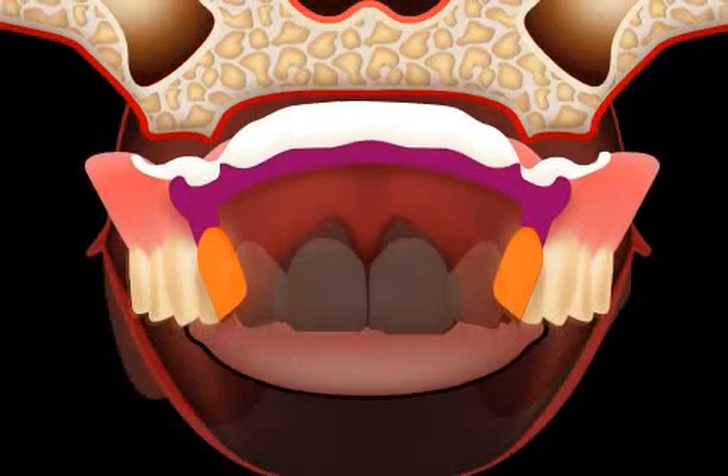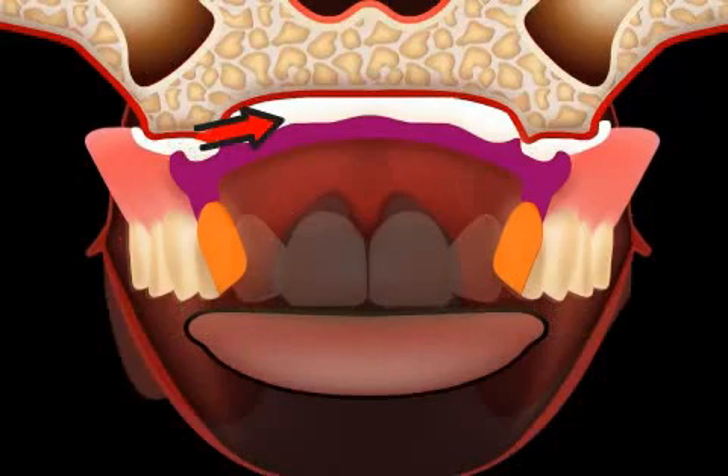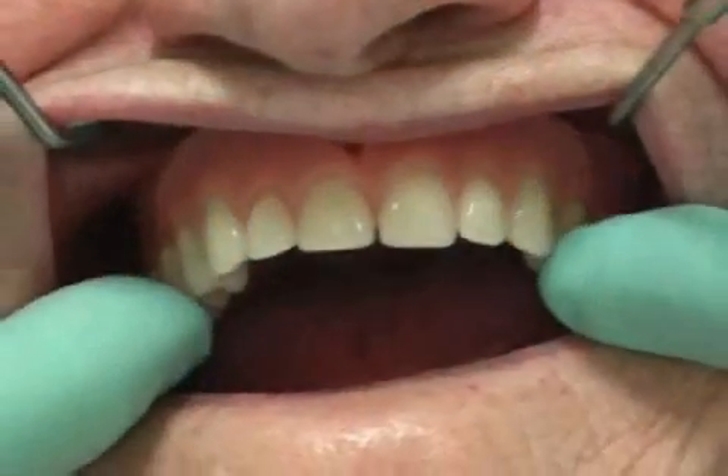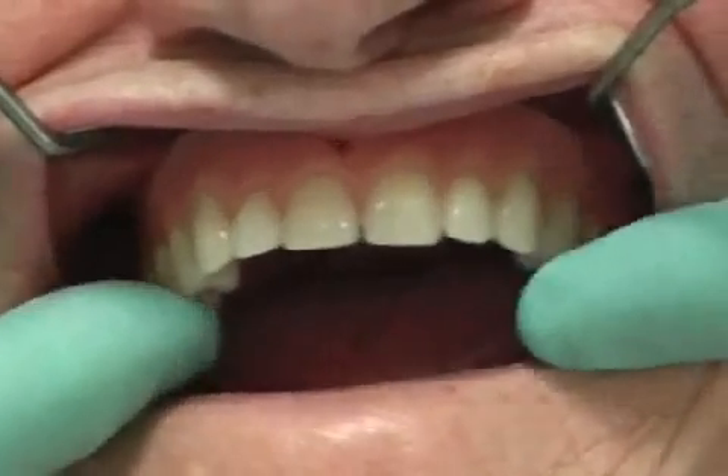When lining a prosthesis, the loss of substance is compensated for with a plastic compound. Here you see a patient with an ill-fitting full prosthesis in the upper jaw, which is why a lining is performed.